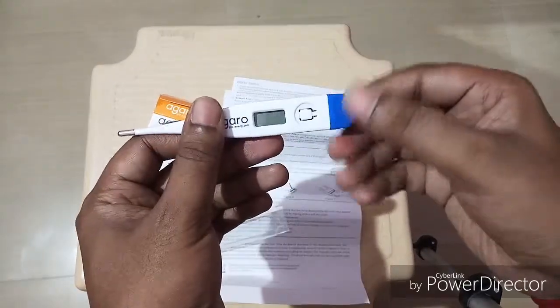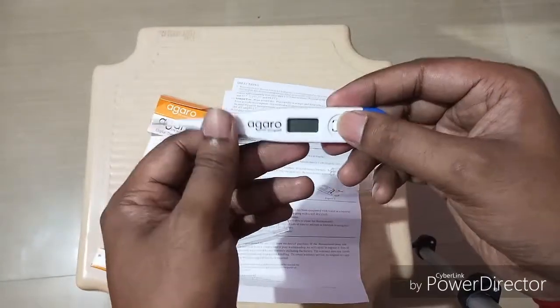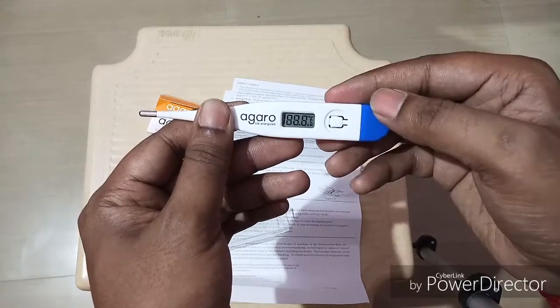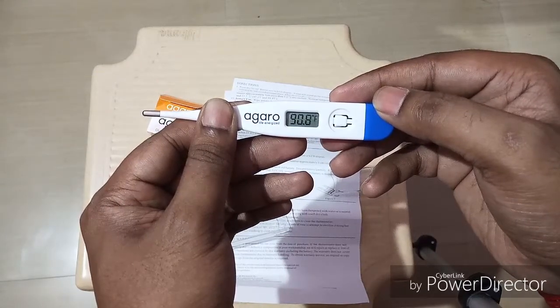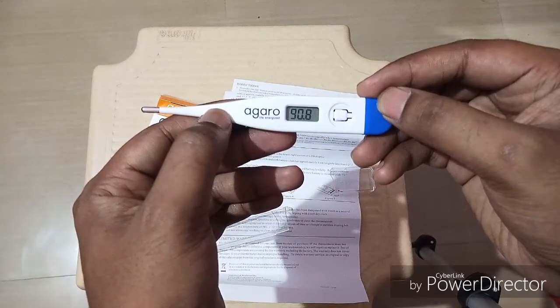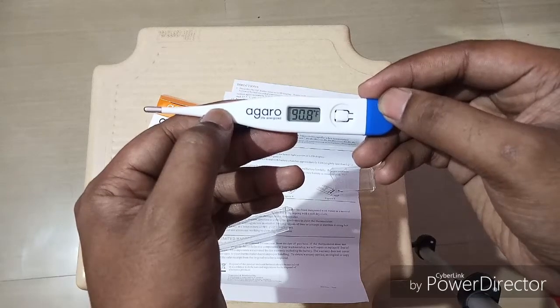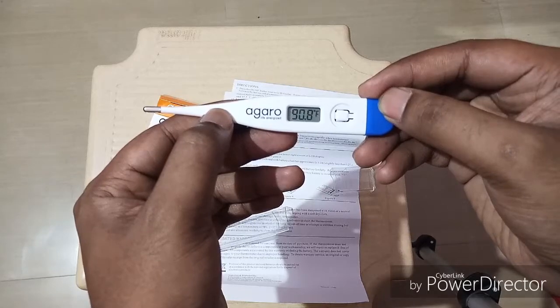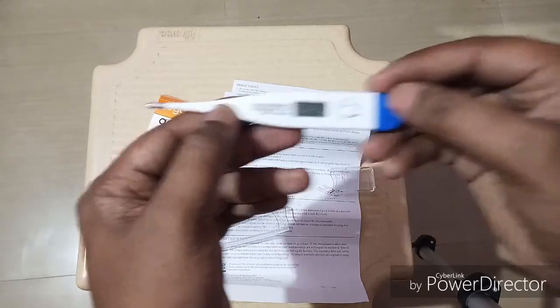To switch it on, just press the button — you can see it switches on. Then you can use it for underarms by keeping it there for one minute. There will be an alarm once it detects the temperature. You can hear that alarm sound — that means the temperature has been detected.